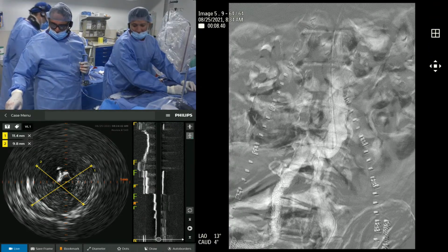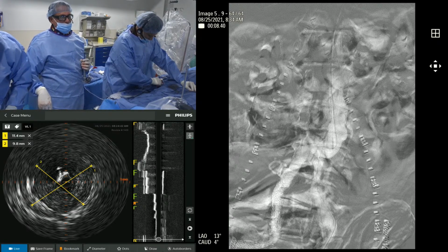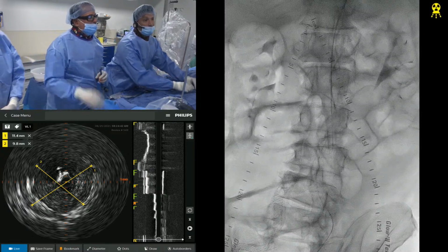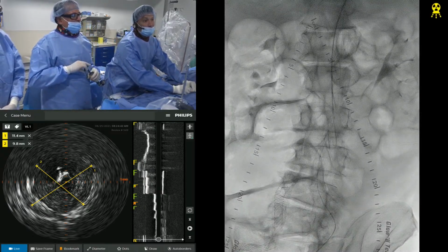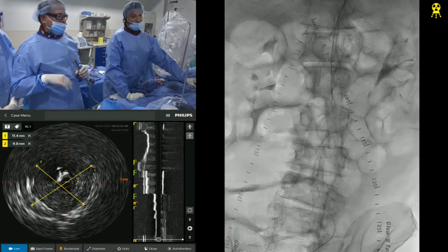Hold on, put it on coronary, Luke. Yeah. We're going to open it up here, and then we're just going to expand this area, and then move it forward, and then do a second inflation above. Yeah, this really speaks to how tight this lesion really was. Yeah, there it goes. Okay, a little bit of love, it went through.